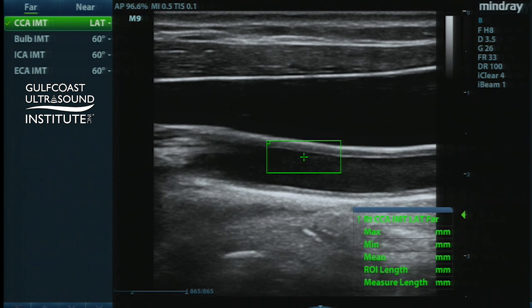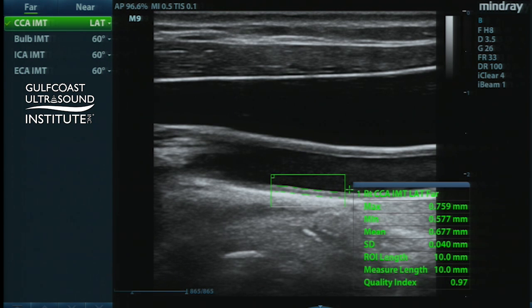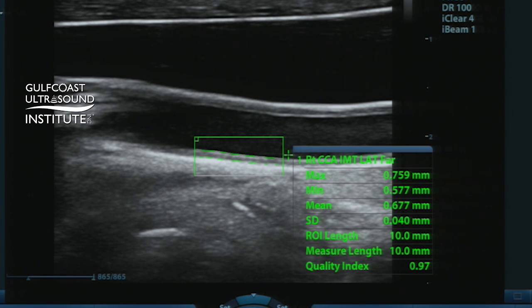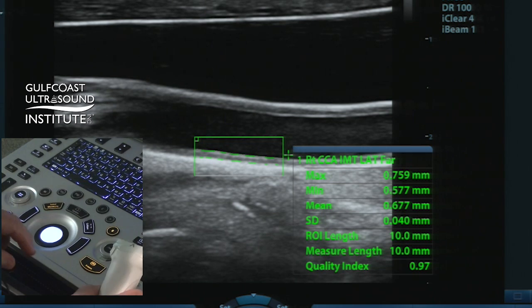That gives us our box, our region of interest. Simply position that and set, and the data will pop up and shows a mean of 0.68 millimeters, with a maximum of 0.76 and a minimum of 0.58. It shows a one centimeter, or 10 millimeter box. The standard deviation for our data points is very, very low, indicating very good data quality, as indicated also by the quality index on the screen of 0.97.